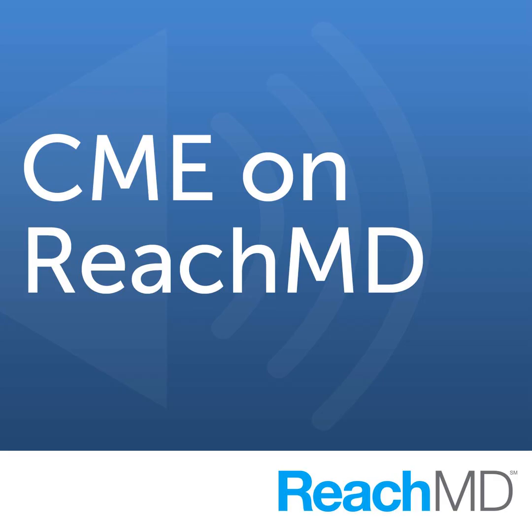Hello, my name is Tomaz Podlesnikar. I'm coming from Slovenia, and my topic today is imaging in the assessment of left ventricular outflow tract obstruction in hypertrophic cardiomyopathy. I have nothing to disclose, and as you have heard from our previous speakers, echocardiography is really instrumental to the detection and to the assessment of LVOT obstruction.